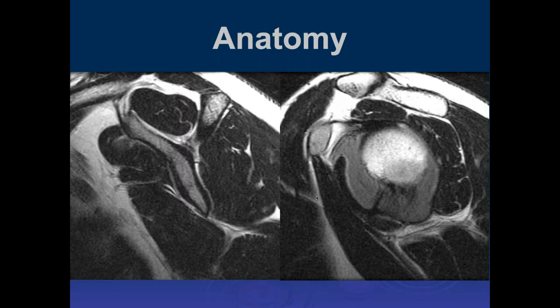Looking at anatomy in the sagittal plane: here's the scapular blade, the acromion process coming off posteriorly, the coracoclavicular ligaments. Going more laterally we can see the humeral head, the coracoid process, coracohumeral ligament, the acromioclavicular joint, and distal clavicle. The muscles visible are the subscapularis tendon anteriorly, supraspinatus, infraspinatus, teres minor posteriorly, and teres major with latissimus dorsi.